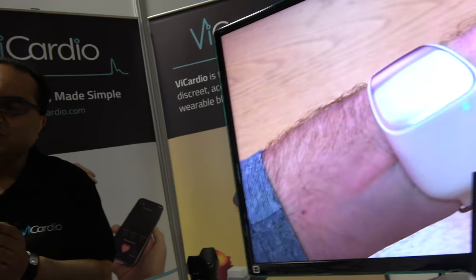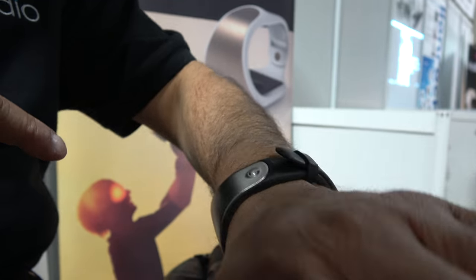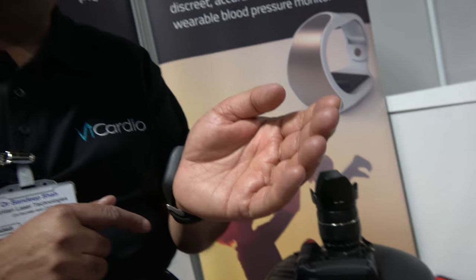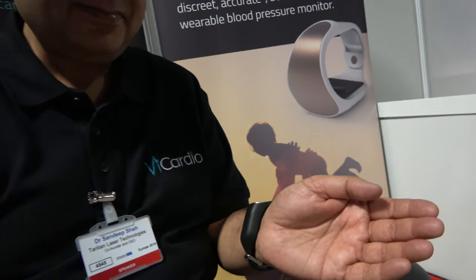It's a small biosensor within a watch framework, and you can see it there. It's very comfortable — putting no pressure at all. The technology works on a continuous basis with no energy entering the body, no need for any compression, and absolutely no calibration either. It's actually even more comfortable than a regular watch.